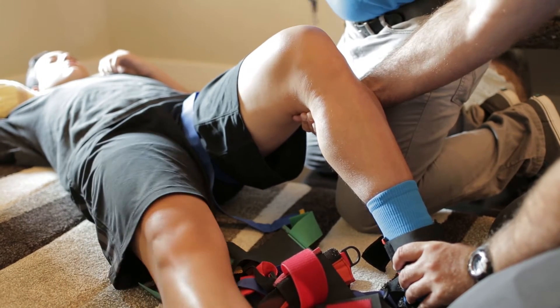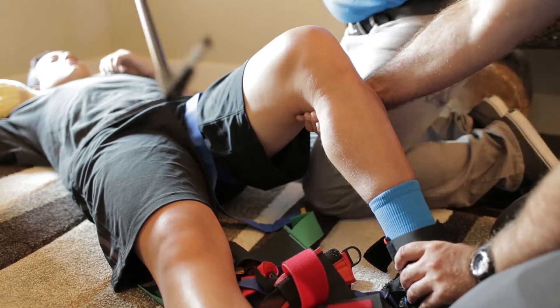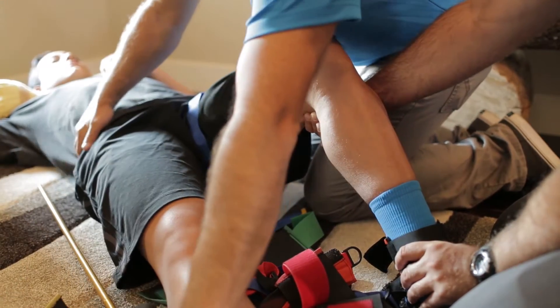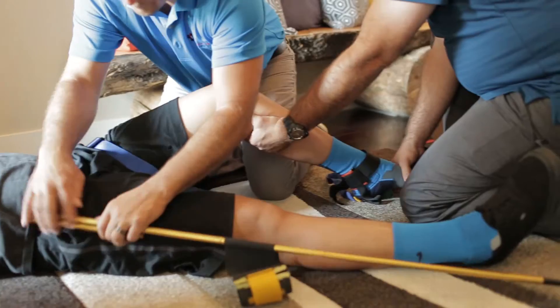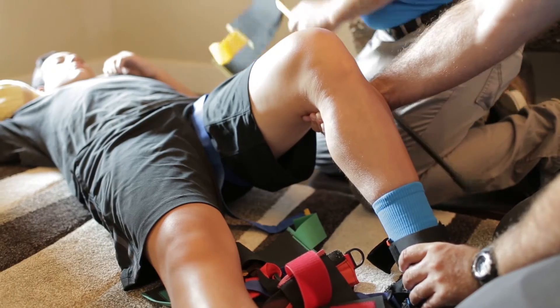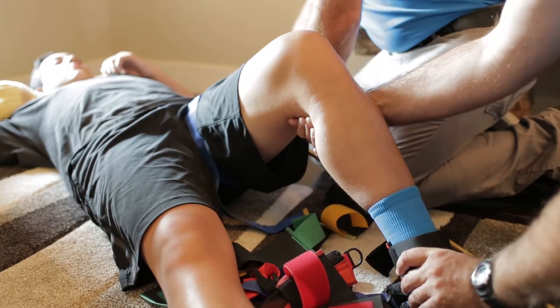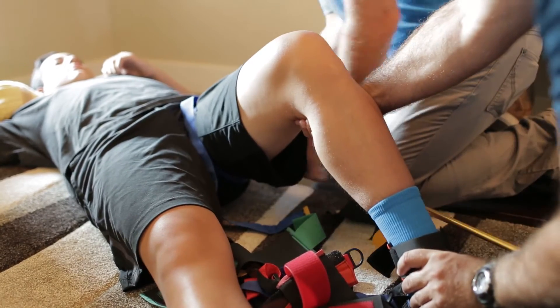In this case, we use this small portable tent pole traction device — it's called a Kendricks. We measure from the top of the iliac crest, or the hip bone, on the good leg, and we want it six inches longer than the bottom of the foot. We come around and put the thigh piece on that the tent pole slides into, taking out whatever sections of the tent pole you need to.